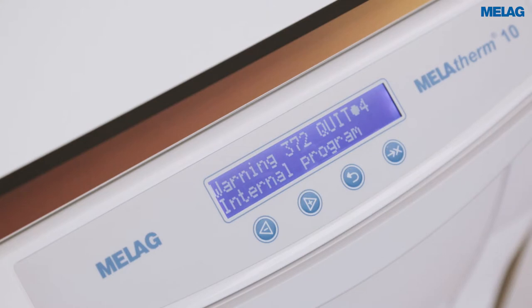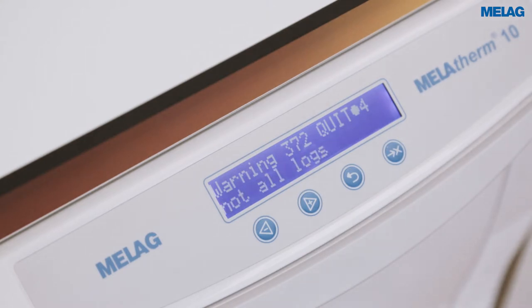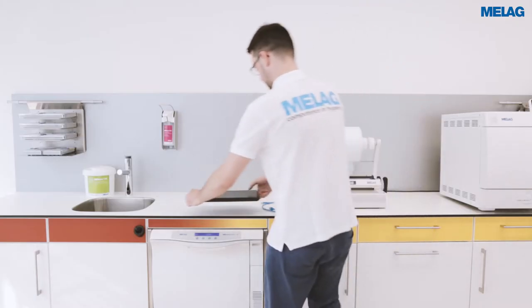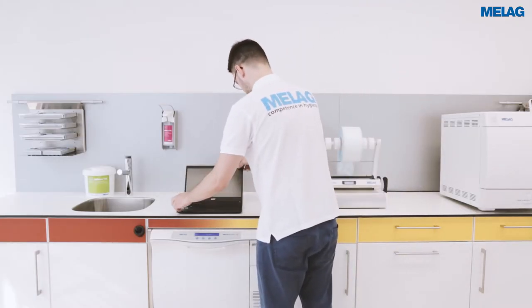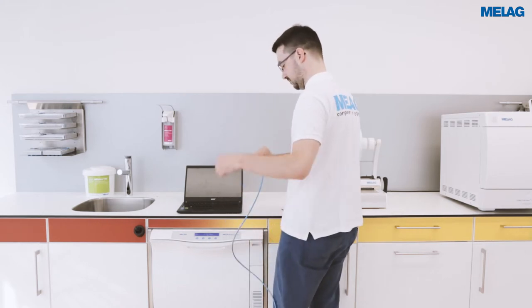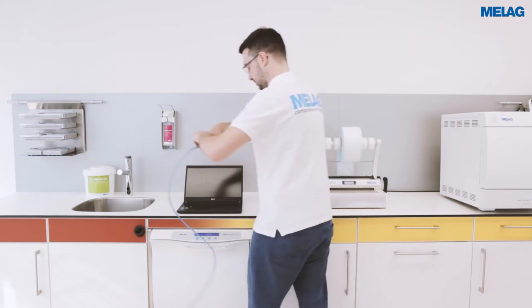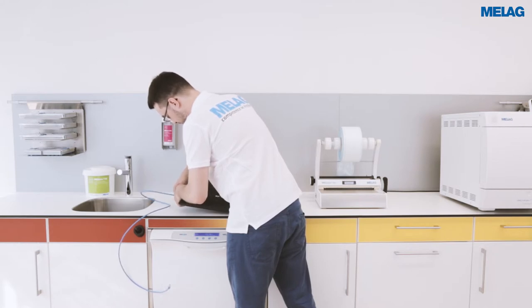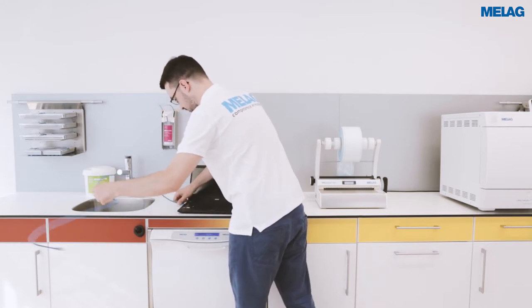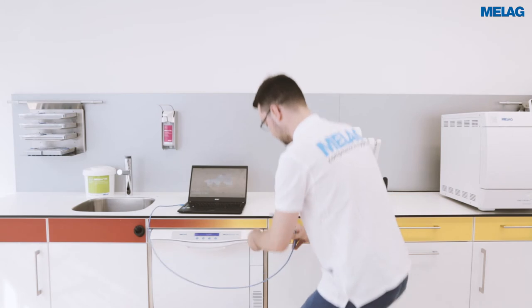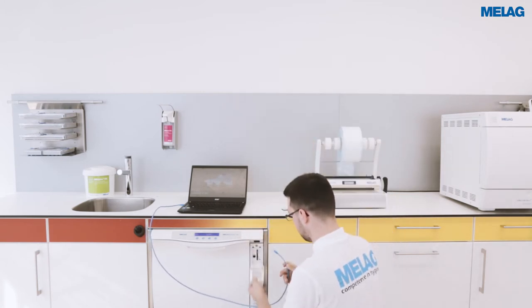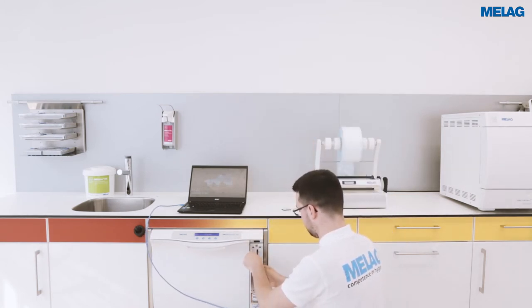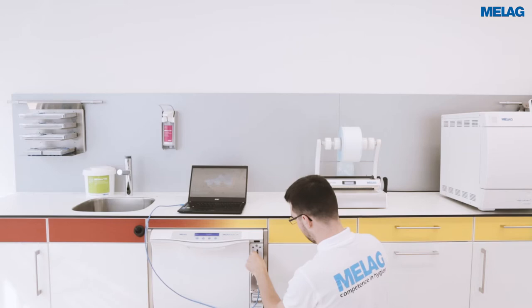This is event 372, which means that the internal log memory is full and the program cannot be started. To solve this event we will connect our computer to the MelaTram 10 and insert a CF card.